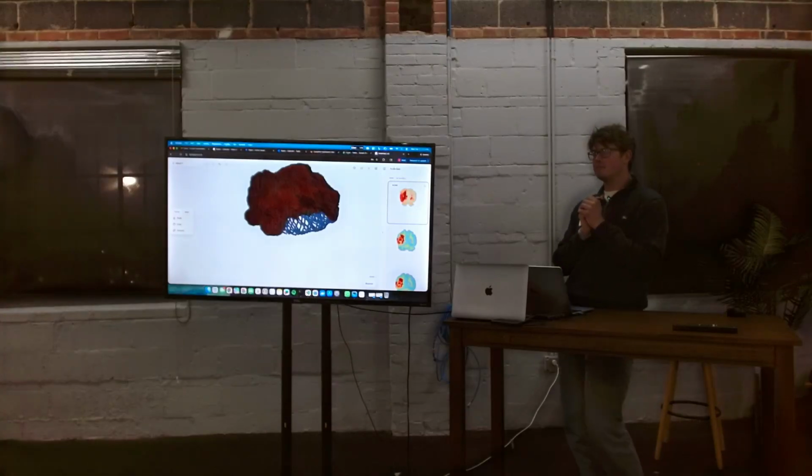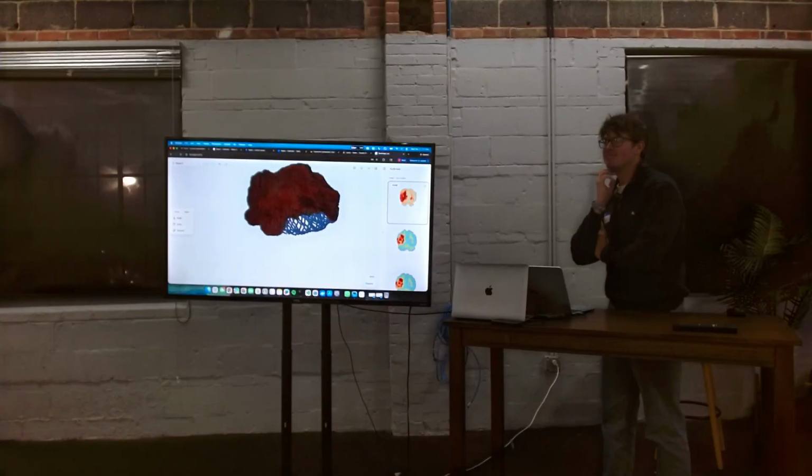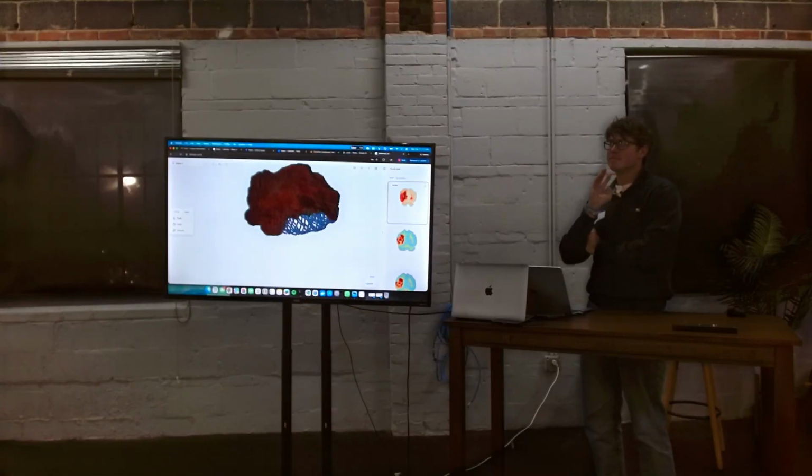You're using DICOM. DICOM is super difficult to use. It's a heavy file. How are you running SAM3? Are you slicing and doing like a video for the visualization and also for the processing? How are you managing this DICOM format? And what is the infrastructure that you have behind this web browser?